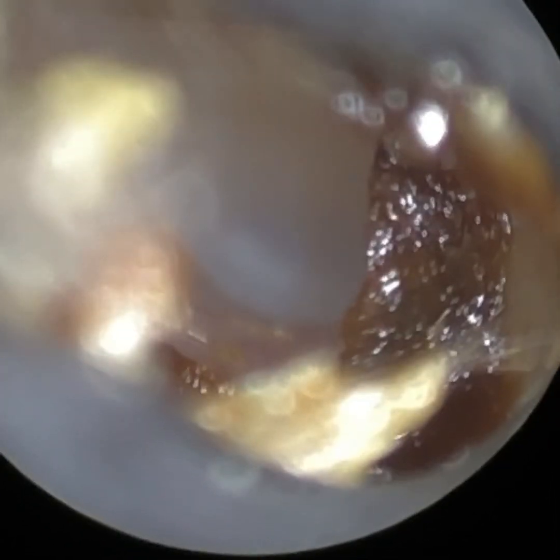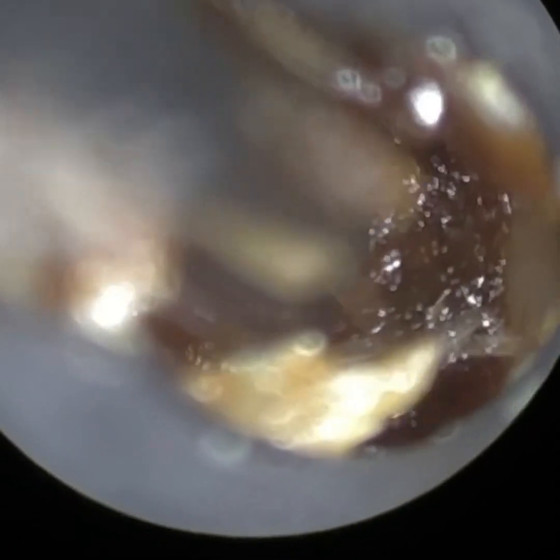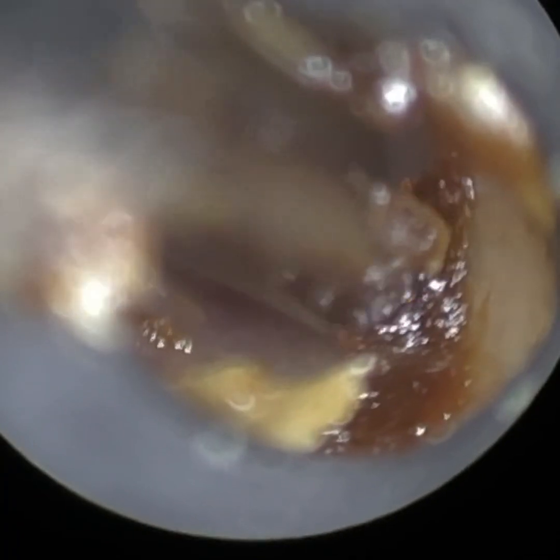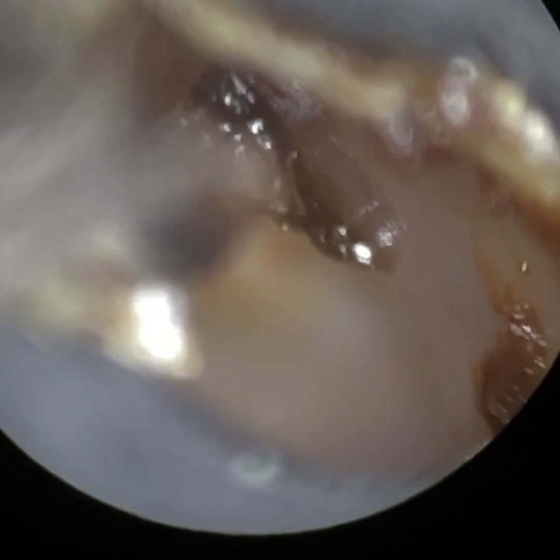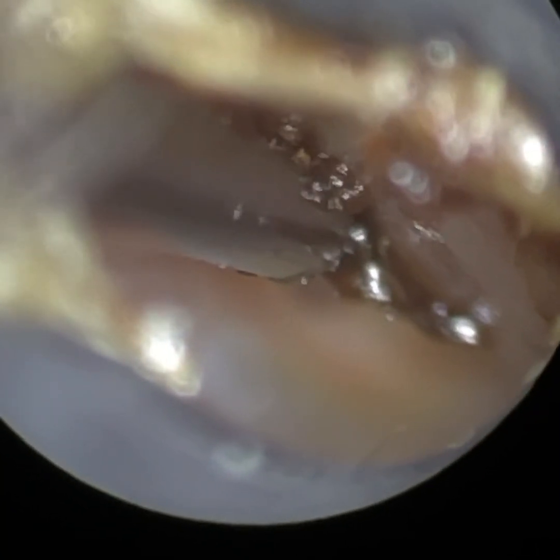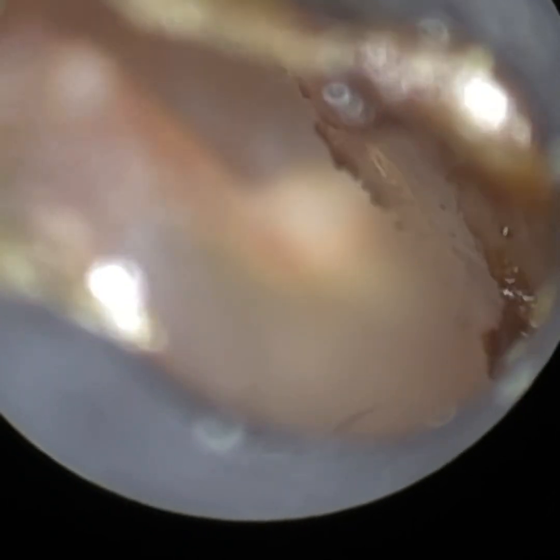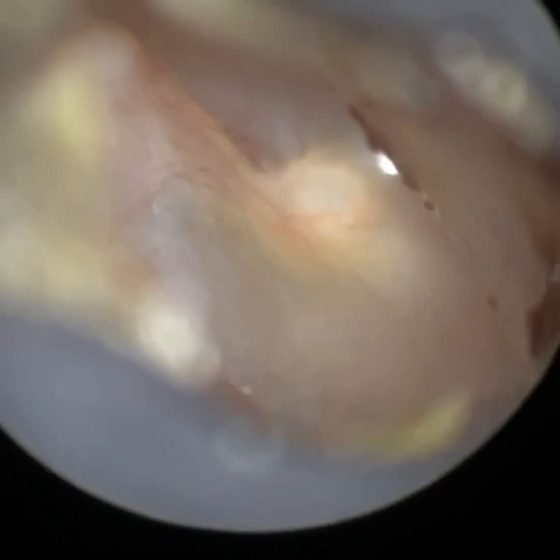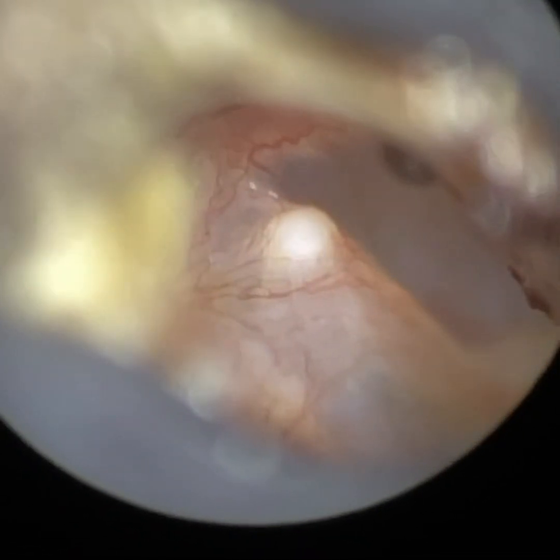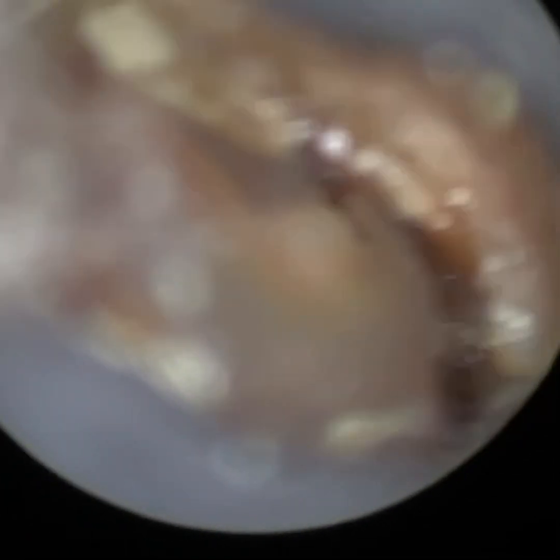It's peripheral skin — I'm just going to leave that. I'm just going to get this bit of wax on the canal wall. I've just got that in focus. I'm using a fine-end suction probe, so as soon as it's in focus, we know we're in the right place. This is a bit further in; I'm just angling the speculum. That's on the anterior canal wall. We're now going to change focus — you can see the eardrum there. Nice and healthy, got a good view. And that's the patient's right ear.